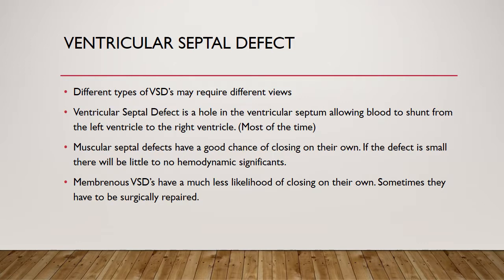Muscular septal defects have a good chance of closing on their own. If the defect is small, there will be little to no hemodynamic significance. I saw a VSD in a 72-year-old — a muscular VSD — that was the oldest one I've ever seen. So muscular VSDs can appear at any time, which is why you need to scan adult patients too.